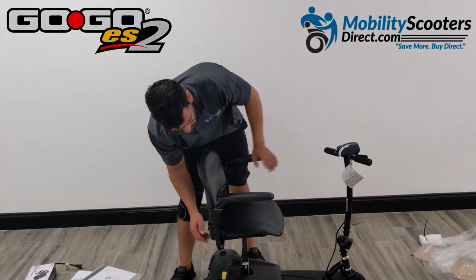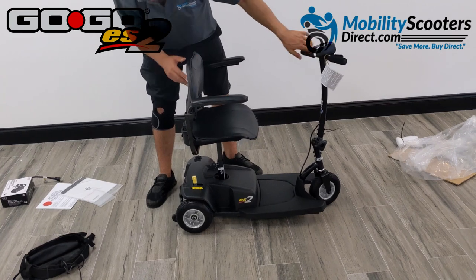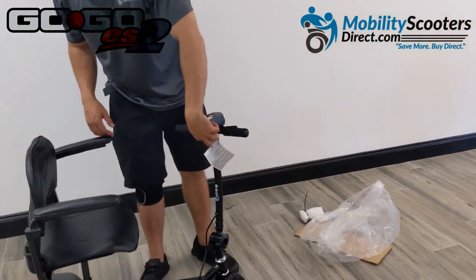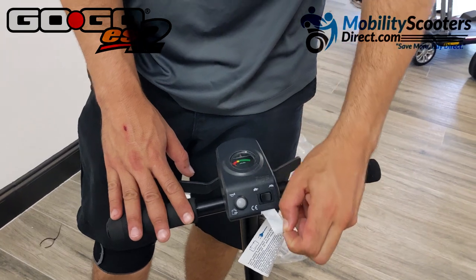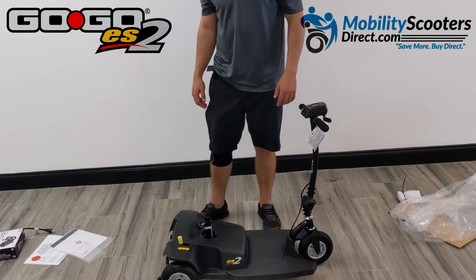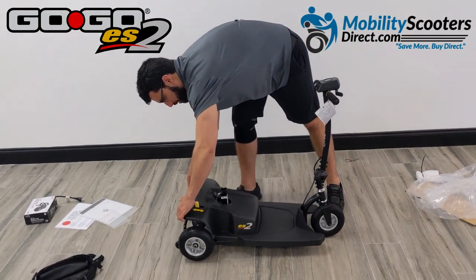Rinse and repeat on the other armrest once you finish the first one. Remember to keep the unit in automatic brake mode — the switch should be in the drive position with the letter D. Don't ride with freewheel mode engaged because the automatic brakes need to be on. This safety feature is meant to prevent users from going down hills uncontrollably if the battery runs out.